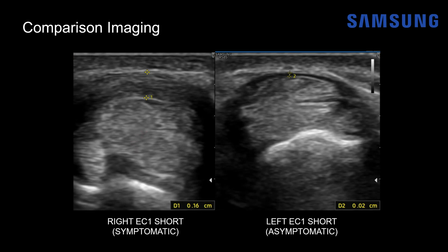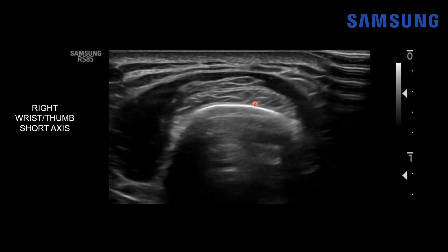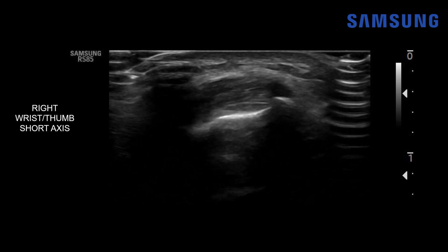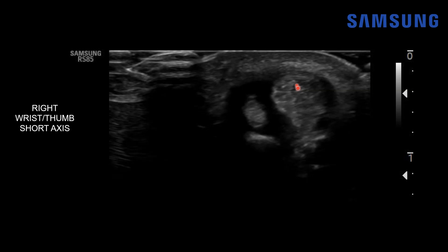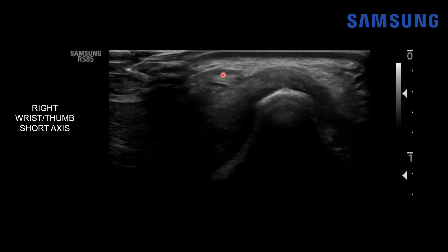On short axis real-time imaging, we start at the level of the radius at the musculotendinous junction of the compartment one tendons. Moving proximal to distal, the compartment one tendons cross over extensor compartment two, and as we approach the radial styloid, the extensor retinaculum comes into view — very thick and hypoechoic. Notice the APL tendon has a striated appearance with hypoechoic slips, sometimes described as a lotus root — do not confuse this with a longitudinal tear. Moving more distally, the EPB branches off toward the base of the proximal phalanx of the thumb, while the APL continues to insert on the base of the first metacarpal.